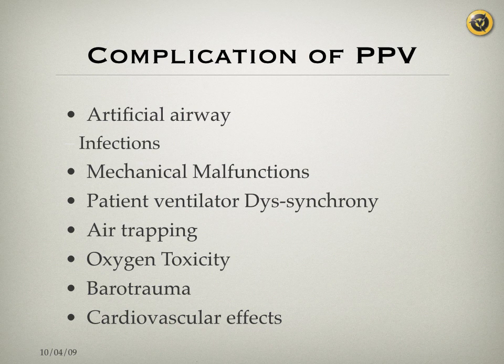Now, air trapping can happen, especially in volume modes. As I told you, with IMV you can have breath stacking. If you're delivering enough pressures and enough volumes but not allowing enough E-time, then instead of delivering the breath after the full previous breath was exhaled, you can stack breaths on top of each other.